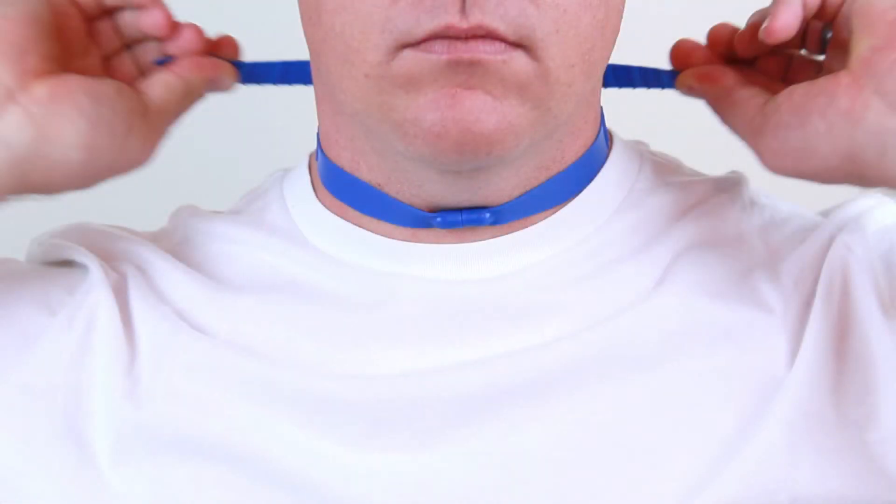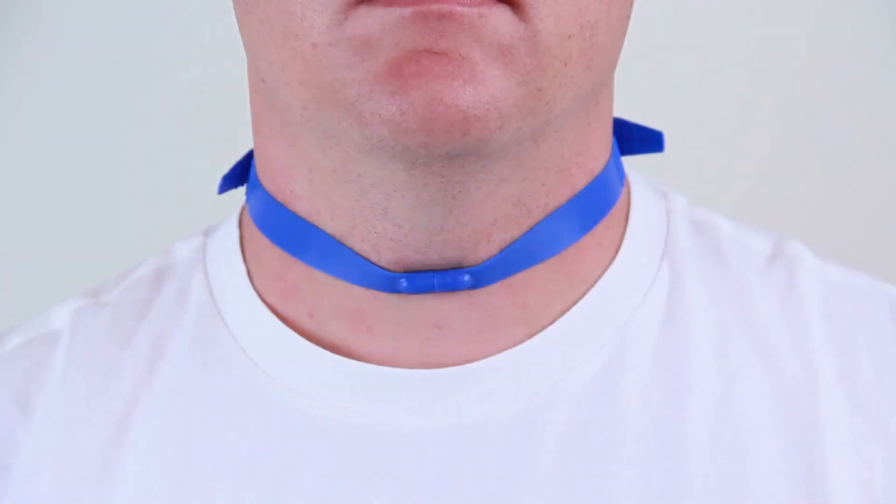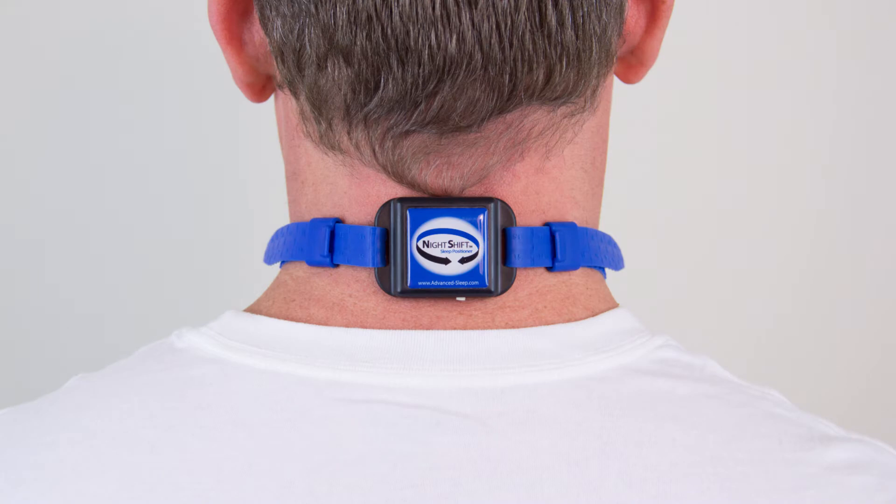Additionally, the straps must be adjusted equally on both sides so the magnet is centered on the front and the device is centered on the back.